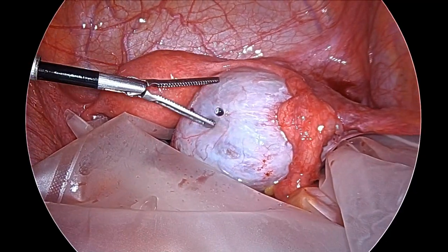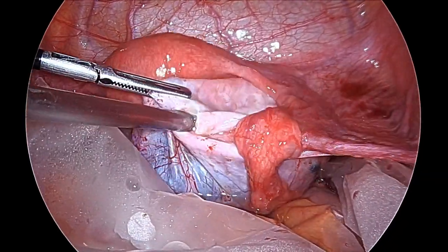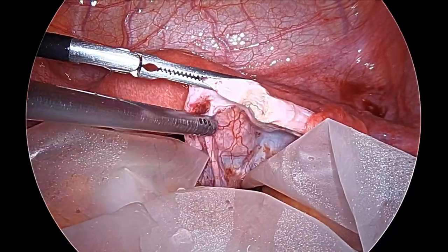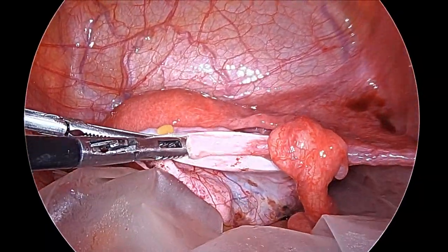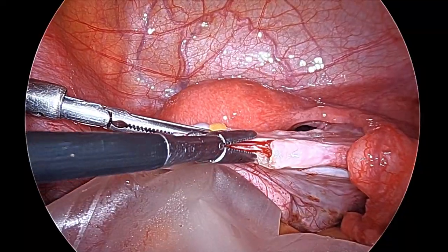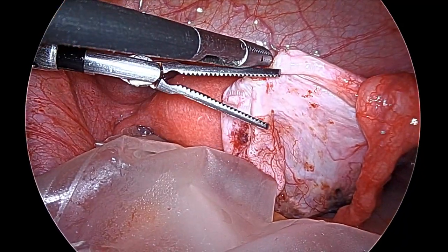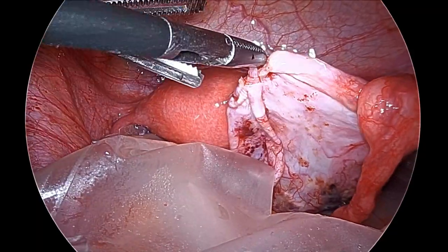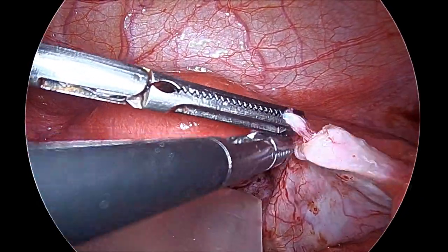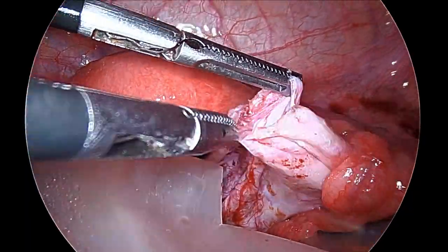After aspiration we apply suction to remove the remaining fluid and also suction within the endobag so nothing spills outside. Then we extend the incision by tearing the margins. A Maryland dissector and a grasper are used to begin enucleation of the cyst using the pushing and pulling technique. This is the inner cystic wall and that is the outer ovarian cortex.